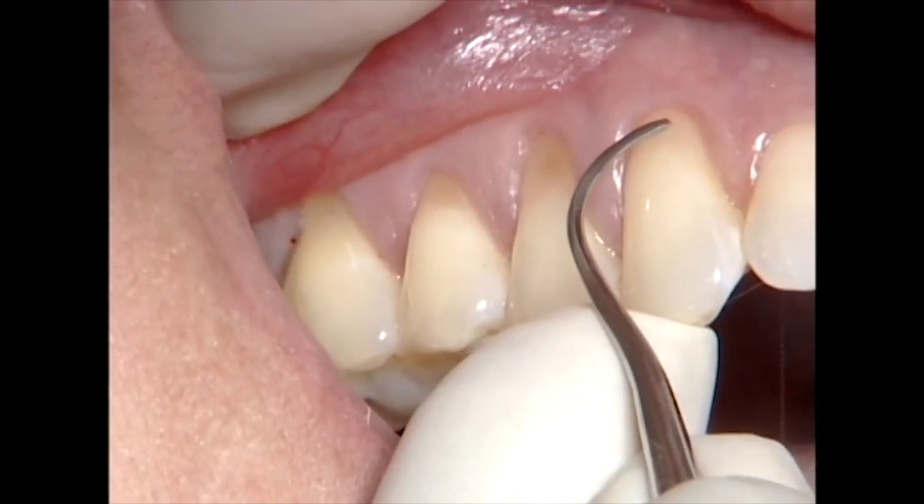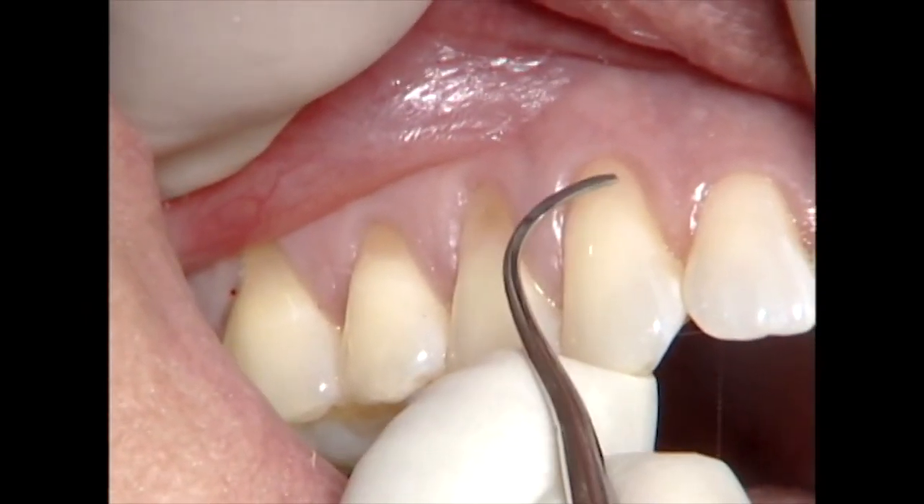So we'll start with the canine. I'm using a Younger Good 7-8 curette that Shannon has sharpened.